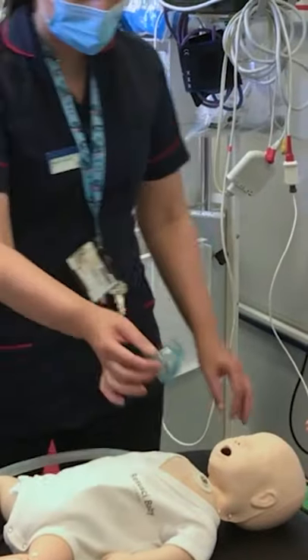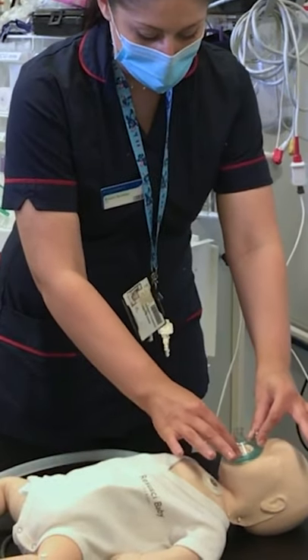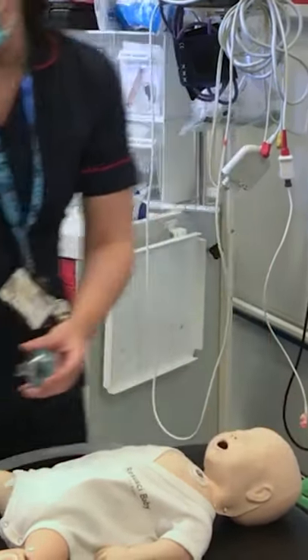Take the red bung off — this is where your mask is going to go. Size up your mask, making sure it covers the bridge of the nose but not covering the eyes, and then it goes below the lower lip but not overhanging the mandible.